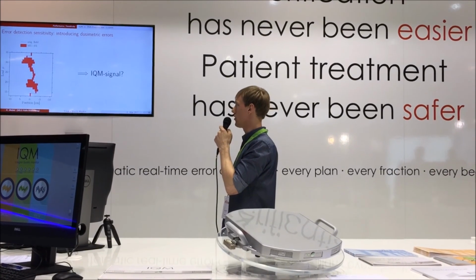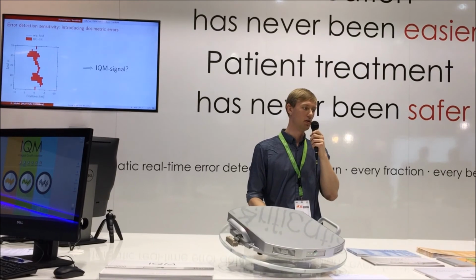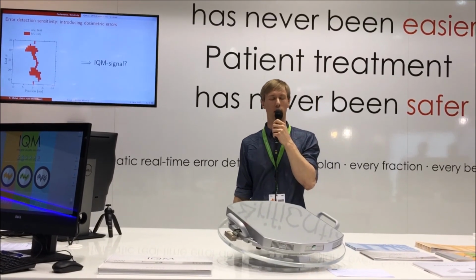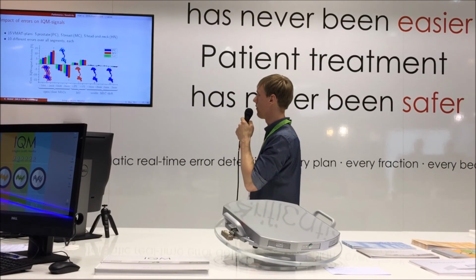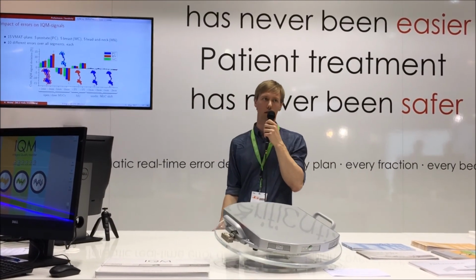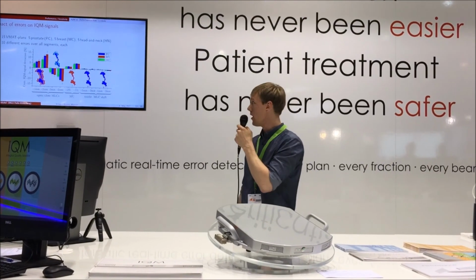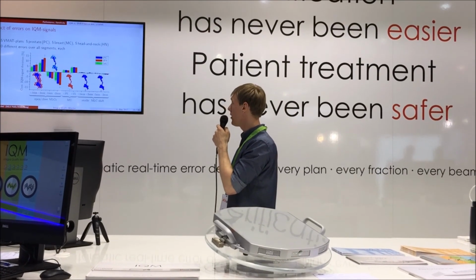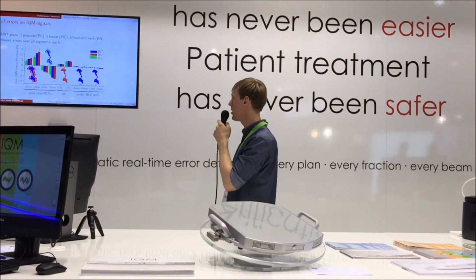And for the dosimetric errors, we kept the original MLC positions as they were and just enhanced the monitor units by 2 or 5%. So we introduced all of those 10 mentioned errors in a total number of 15 clinically applied VMAT plans. We had 5 prostate plans, 5 breast cases, and 5 plans for head and neck tumors.